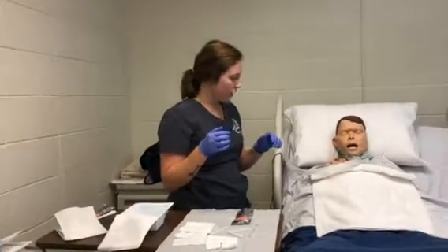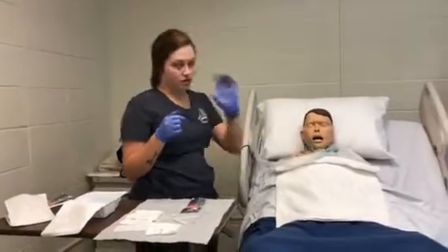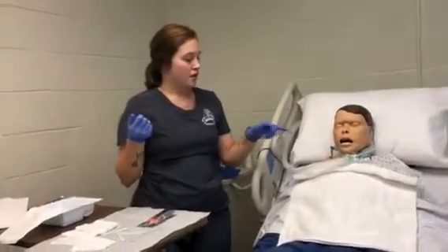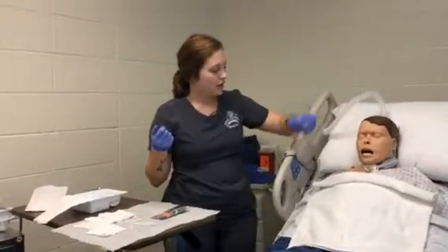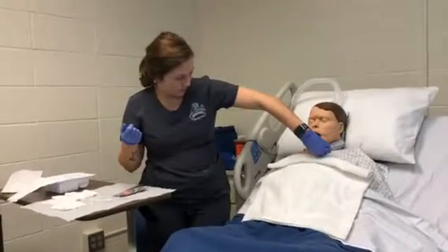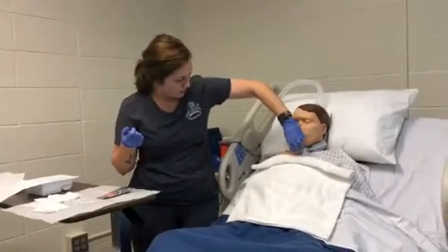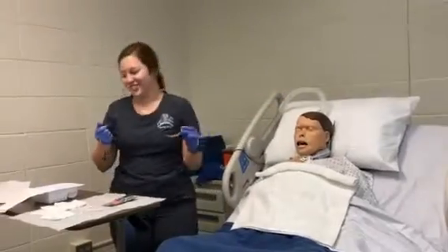Okay, so now I'm going to, again, have one unsterile hand and one sterile hand. My dominant hand is going to remain sterile. My non-dominant hand I'm going to use to move the oxygen out of the way and to remove the inner cannula. It's hard to get these out.